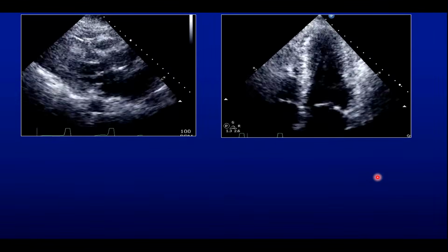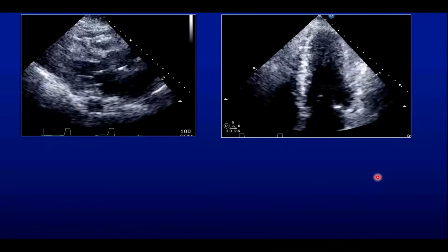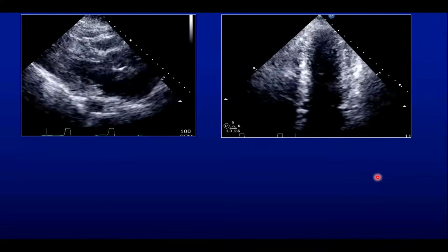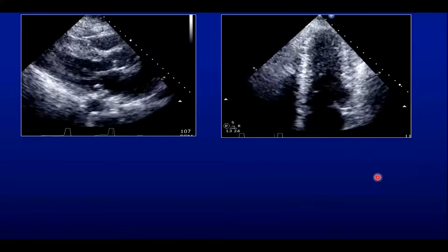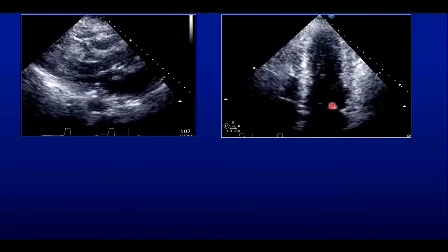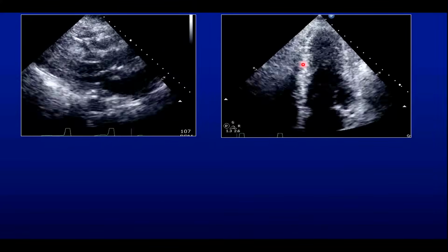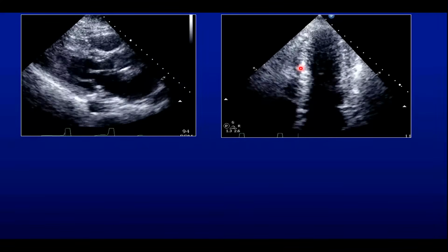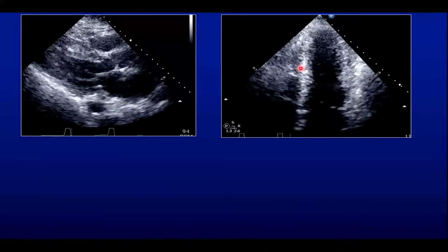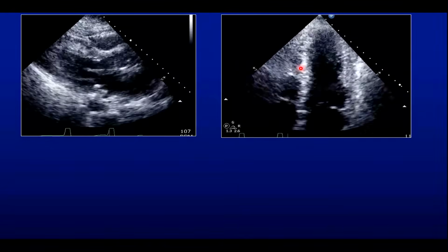What do you think? What's the situation here? Probably it could most likely be a hypertrophic heart. You're really not sure. But I'll tell you, without contrast, one thing that is definitely abnormal: usually in a heart you have endocardial motion, right? But usually you have epicardial motion that comes towards the middle of the cavity.